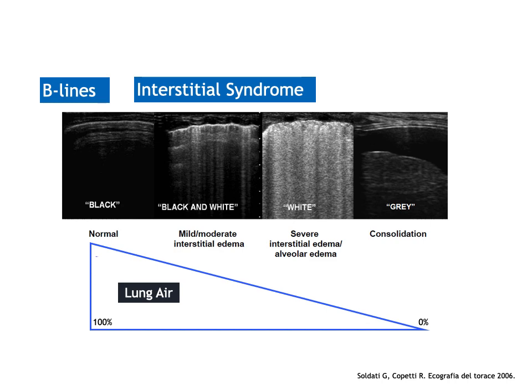And finally, you see the worst degree, which is concomitant with a severe loss of aeration. This always happens in patients with consolidation, in which the air is replaced by tissue, in which the lung is hepatized. And the pattern is often gray in patients with consolidation.